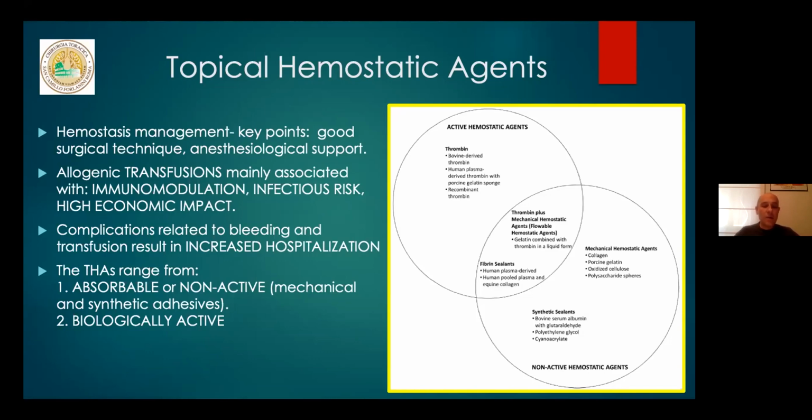So several products have been proved to improve intraoperative bleeding control. However, variation in their use exists because practice guidelines reflecting the current medical evidence have not been developed.